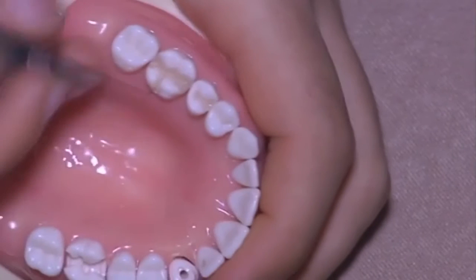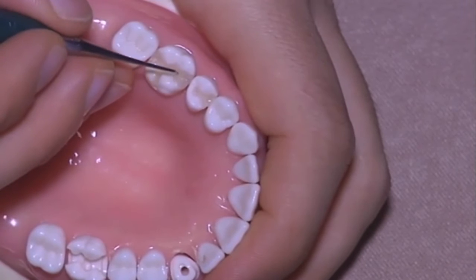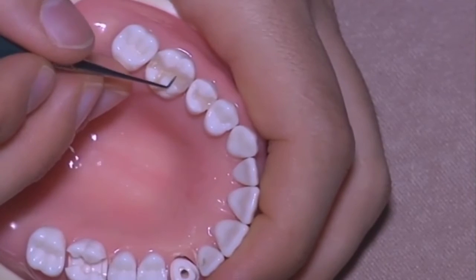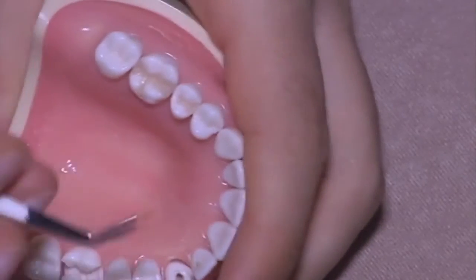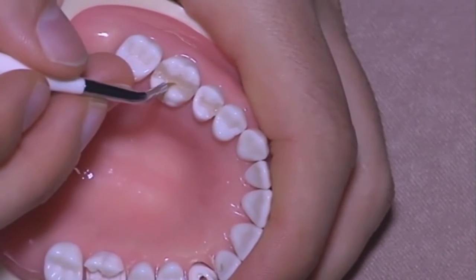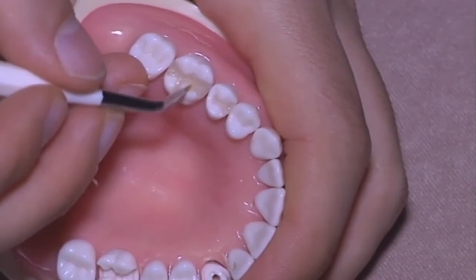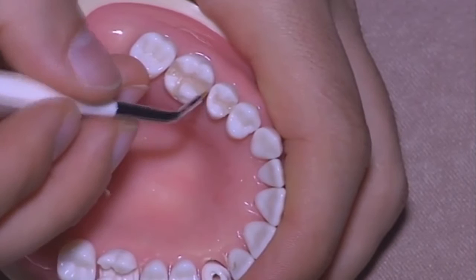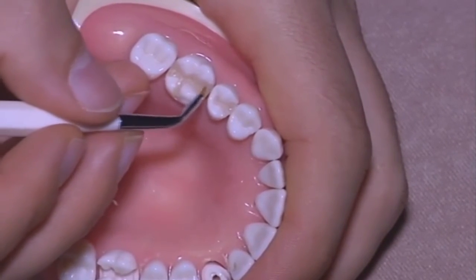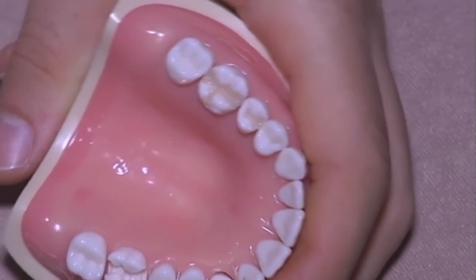in anterior teeth you have to avoid using the brush with the adhesive on it, because you get a yellowing effect because of the camphoraquinone. The camphoraquinone is yellow, and if you use the brush for the composite adaptation, you increase the amount of camphoraquinone on the surface of the composite, and the consequence is a yellowing effect that will result in not a perfect color adaptation of your restorations.